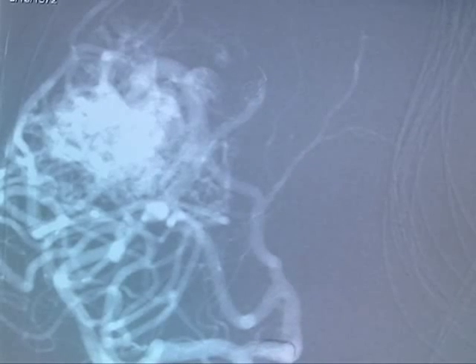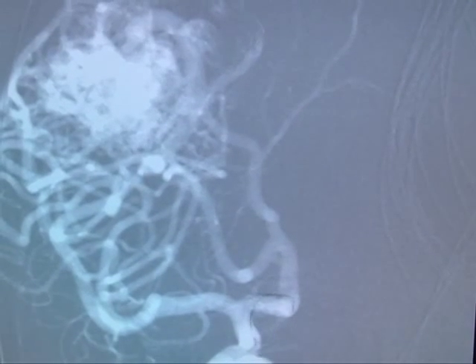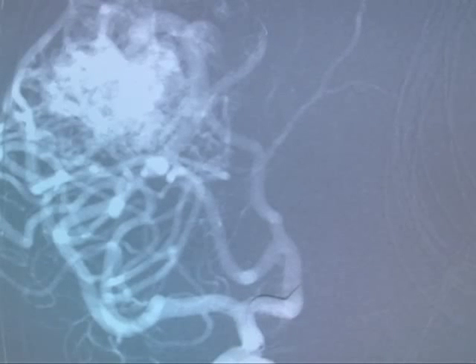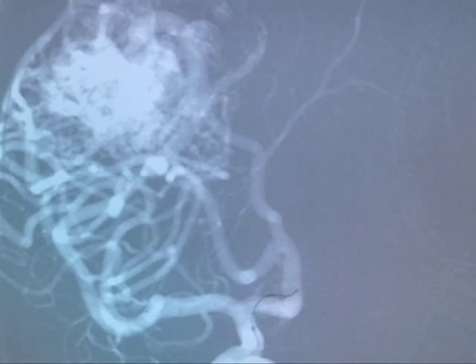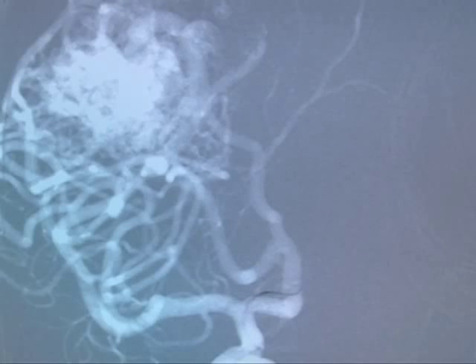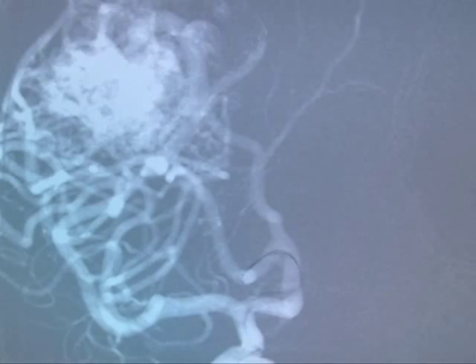The catheter has been removed, and a fresh catheter is now being advanced over wire into another vessel that feeds the arteriovenous malformation. We will advance it into another branch of the anterior cerebral artery that gives blood supply to the AVM. That branch also will be tested with lidocaine and amytol, and if the patient does not show a neurologic deficit, we will move on to embolize that branch using Onyx-18.